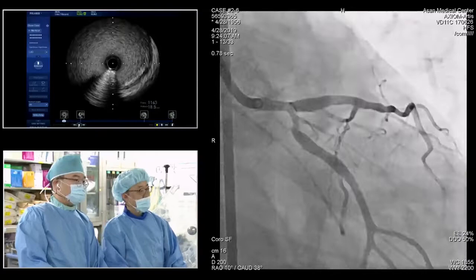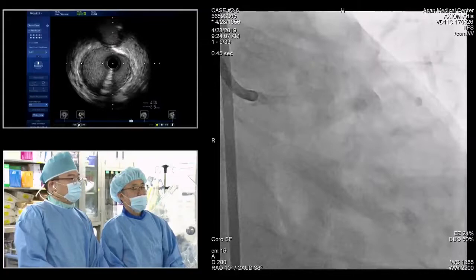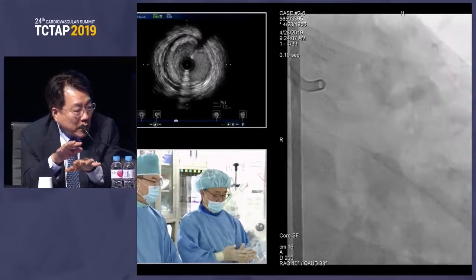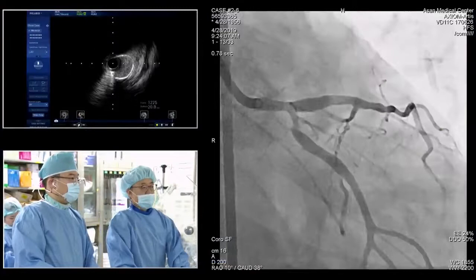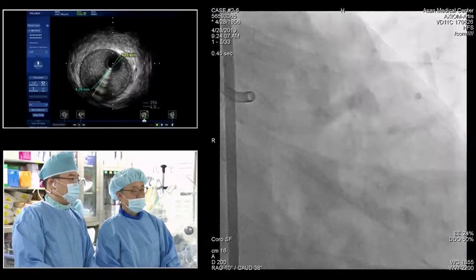Okay, the IVUS findings are pretty clear, so I've got two options. Even though anatomically it is not so tight on the LAD side, we have to consider two stents from the beginning. If the plaque is not so much, I believe the long-term stent outcome should be good. So two stents would be good. The second option I'd like to consider is a stent from the circumflex to the left main, kind of a culotte without the LAD stent. Just stent crossover from the circumflex to the main and kissing balloon inflation for the LAD, and then we're going to see what's happened.